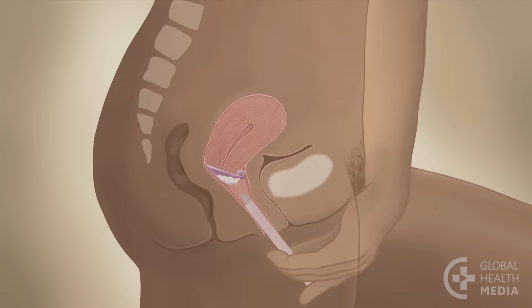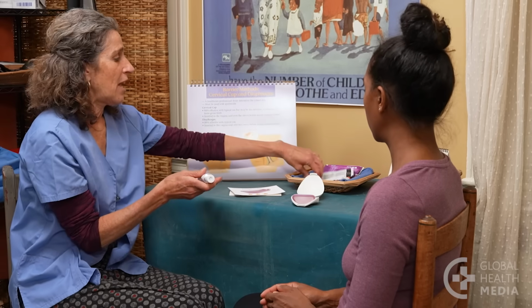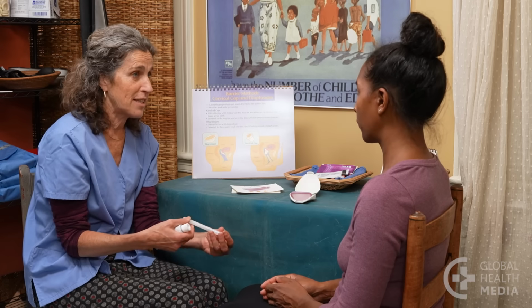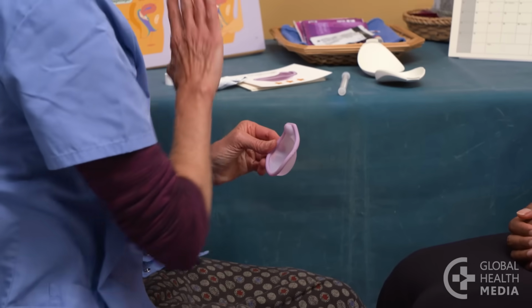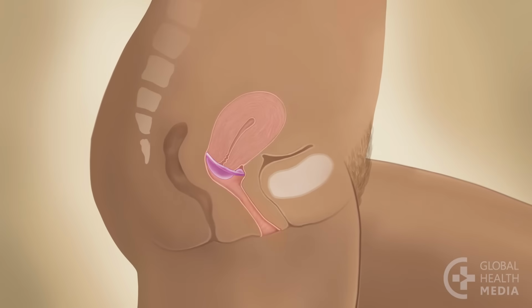After sex, leave the diaphragm in place for at least 6 hours. If you have sex again, don't take the diaphragm out. Instead, insert more contraceptive gel into your vagina before having sex. And wait 6 more hours, the time it takes for sperm to die. Be careful not to leave the diaphragm inside longer than 24 hours, or you could get an infection.